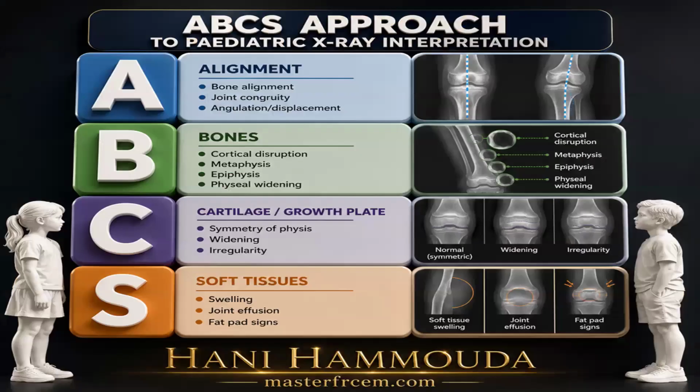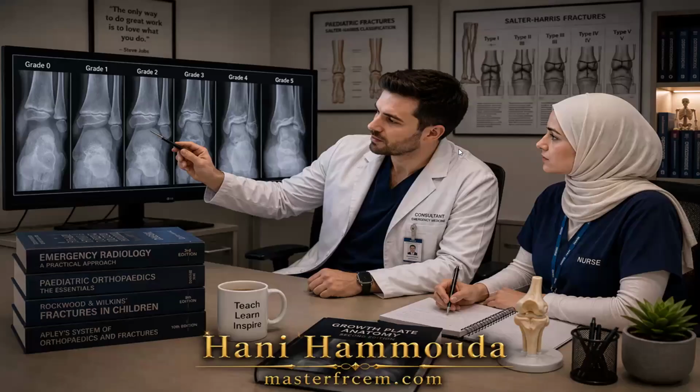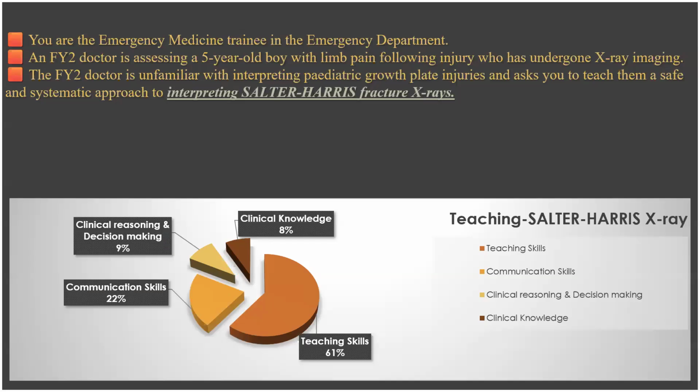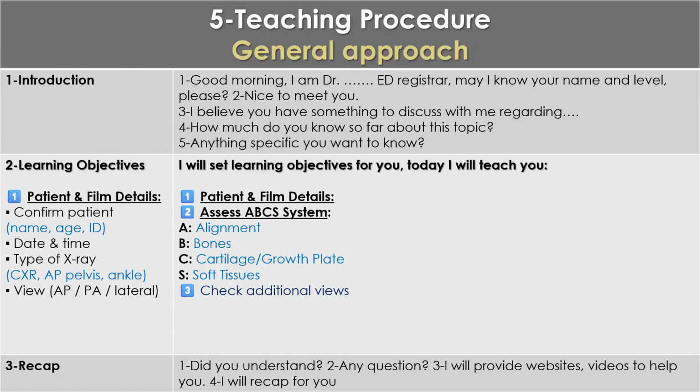You have 30 seconds and 6 minutes. Okay. Good morning. I'm Dr. Rosimon, one of the ED Reg. May I know your name and level, please? Nice to meet you. I believe that you have something to discuss about a pediatric X-ray, the Salter-Harris fracture. How much do you know about that? Do you want to know anything specific?